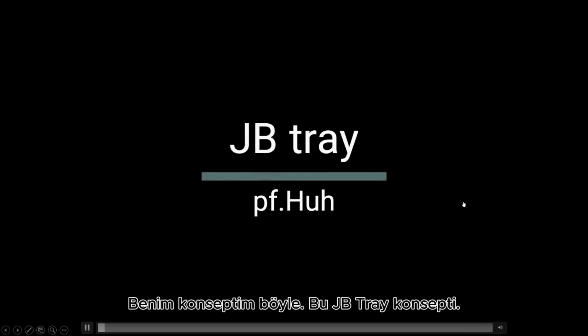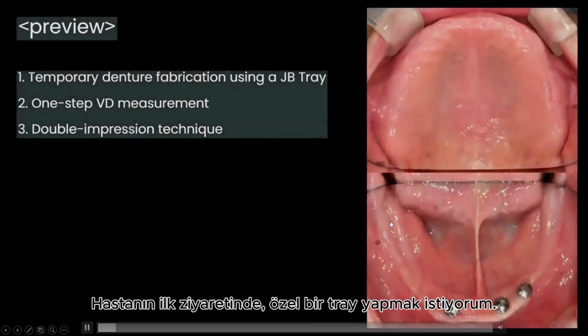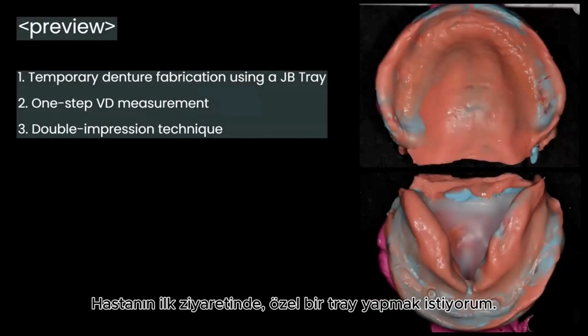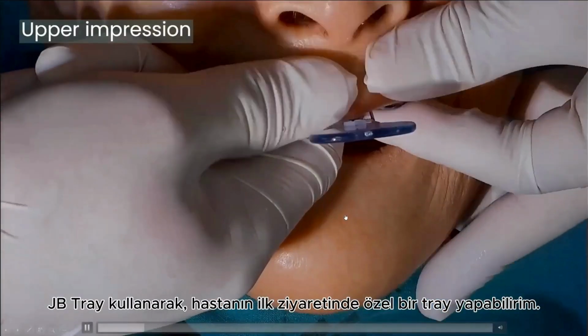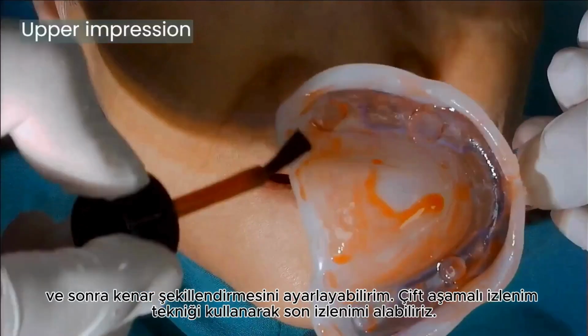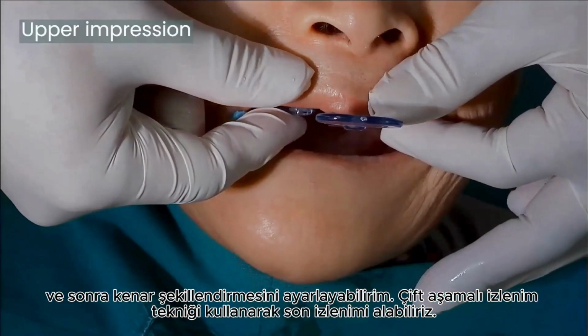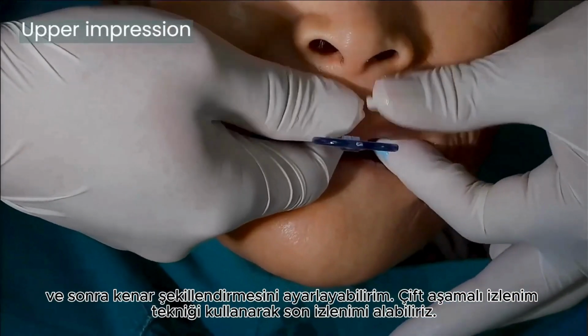So my concept is like this. This is the JB Tray concept. At the first visit of the patient, I want to make a custom tray. Using the JB tray, I can make a custom tray at the first visit, adjust the border molding, and then do a final impression using the double step impression technique.